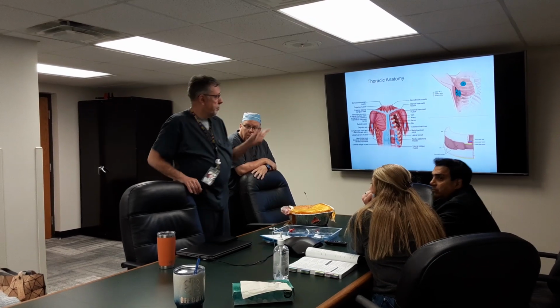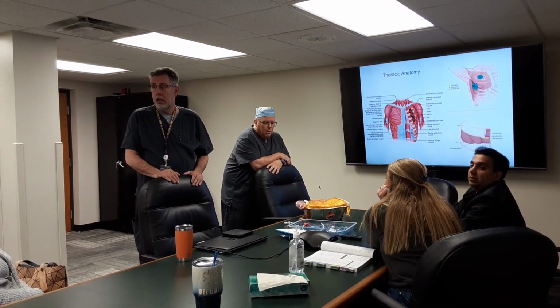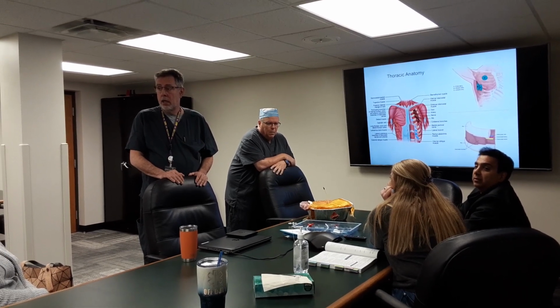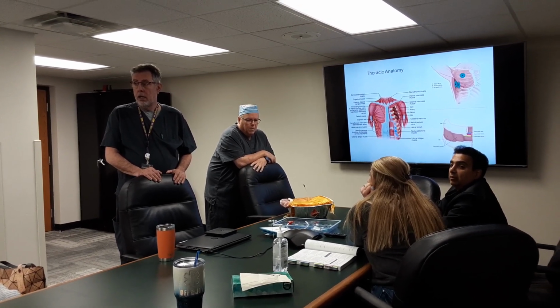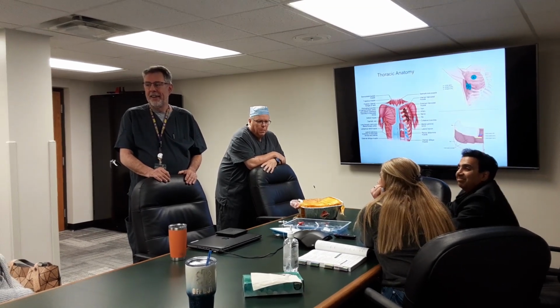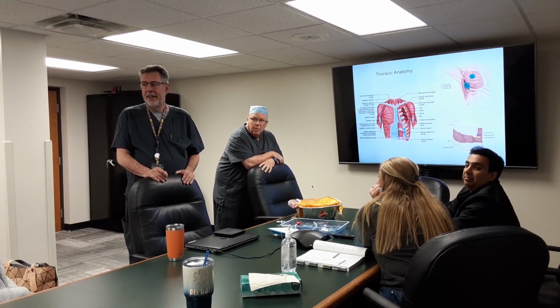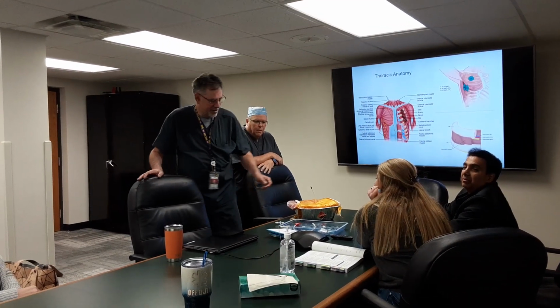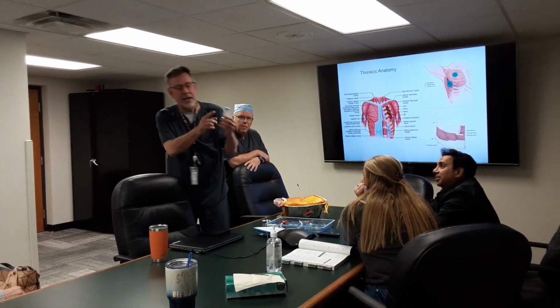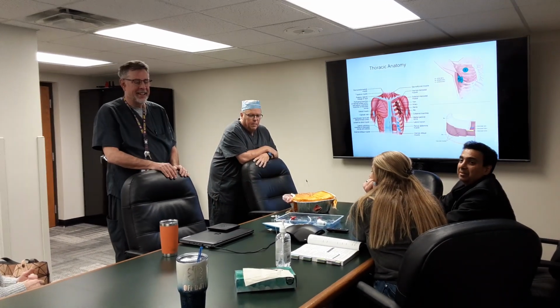Just a reminder, one of the medics comes in with one mid-clavicular, we're probably using a finger of a glove for our valve. So don't pull it off like you're cleaning the patient up when you come in. I've had a doc do that where he walked in and thought he was being nice and pulled the finger off like he was cleaning the patient's chest off. That's my version of it. We just clip the finger off, we stick the needle through it, then put it into the chest, and it's basically its own little flapper valve.